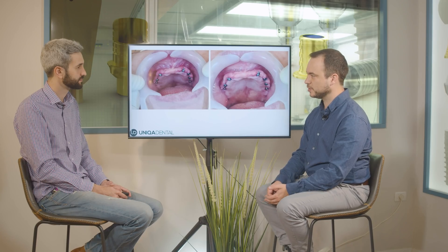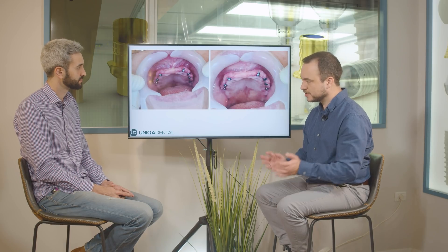On the lower jaw there is a temporal bridge on teeth, and a little bit later we'll change to a zirconia bridge. But on the upper jaw we don't have anything at all. So we need to know what the height of the teeth will be, what the patient's VDO — vertical dimension of occlusion — is, and where the central line and all the anatomical configurations of the bridge should be.